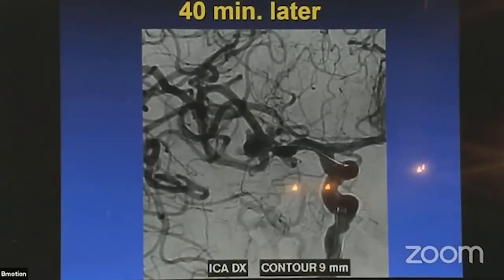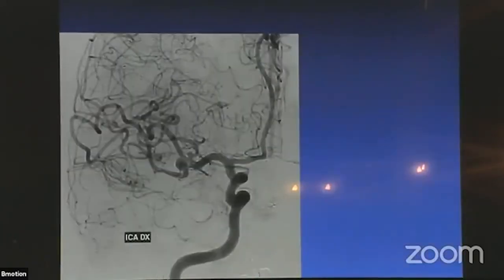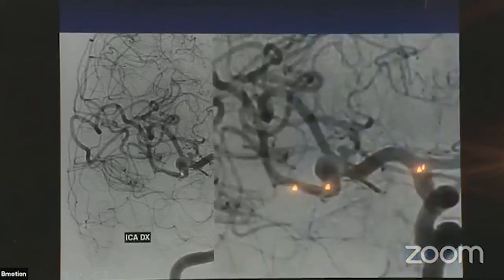I waited 40 minutes before detachment. After 40 minutes, the blebs were much less filled, both branches were filling normally, so I said it is possible. I replaced it to a smaller 9 mm device — which gave more space around the device for blood flow. This is the final angiogram and the 7-month follow-up. The aneurysm got smaller. All the blebs are thrombosed. I like this result, but it's still not fully occluded.